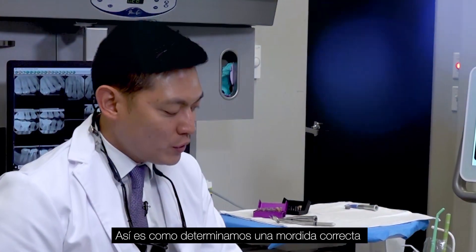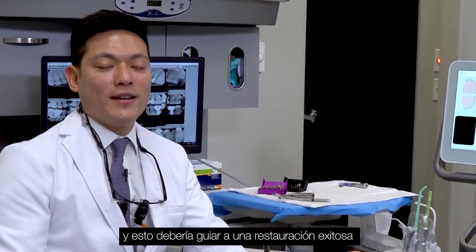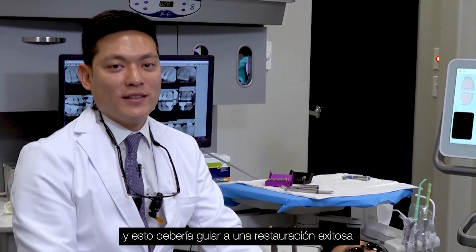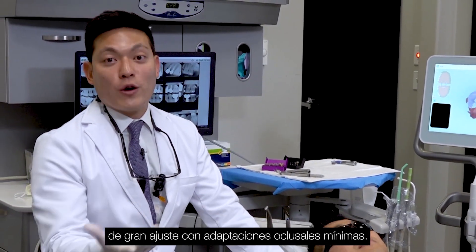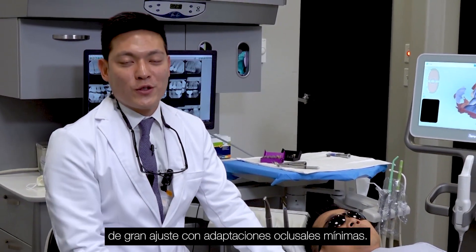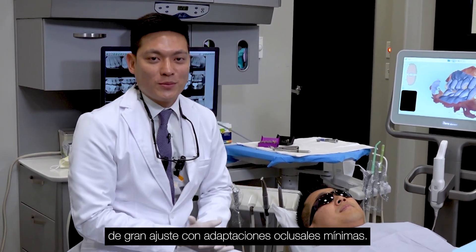So that's how we establish an accurate bite, and that should hopefully lead to a successful and great-fitting restoration with minimal occlusal adjustments.